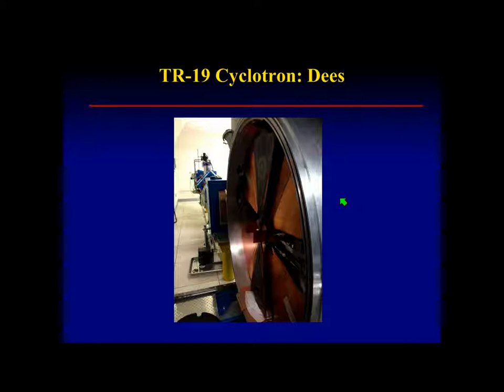If you've seen the inside of a GE machine, essentially this is what you see. They're vertical. That was what I showed you or pointed out for our traditional. And what happens with the Ds essentially is that when the particle is injected into the center, these Ds change charge, positive to negative, about 10 to the 6th times per second. So again, what we're trying to do is attract that negative ion to the positively charged D, and we maintain it in a circular path. By the end of the path, the particle will have acquired the energy that we are trying to achieve.